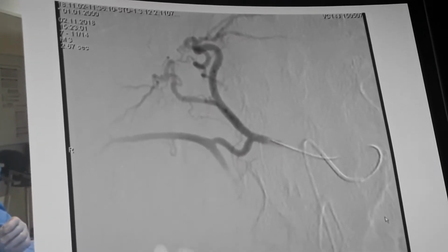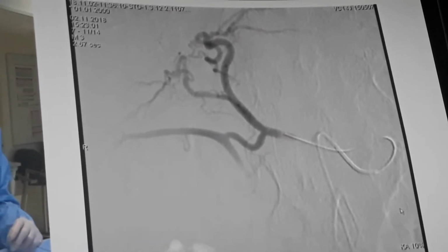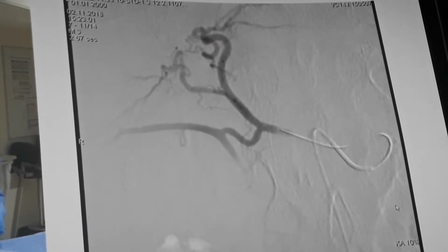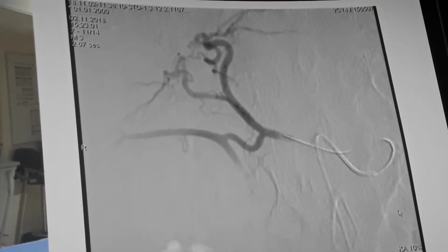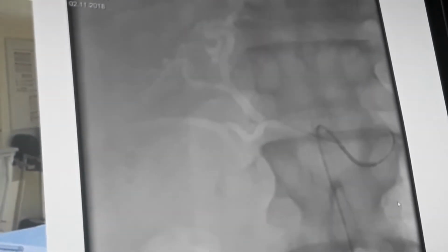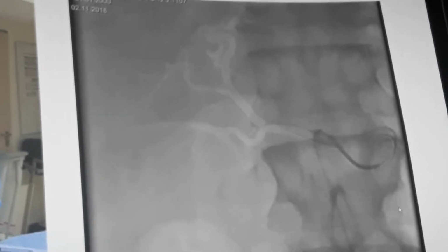And I'm going to continue with the micro catheter and the micro wire. The saved images can be used in an overlay and can be superimposed onto the X-ray image. And when the catheter will hopefully move in the right direction.